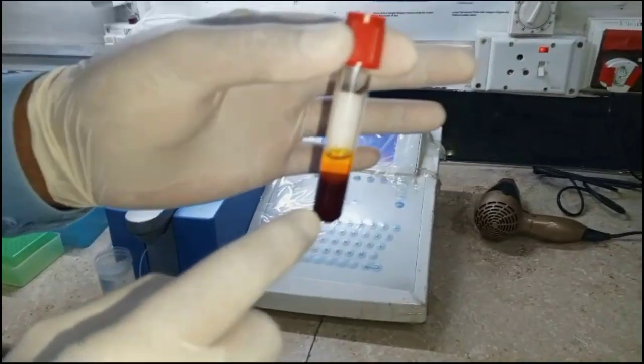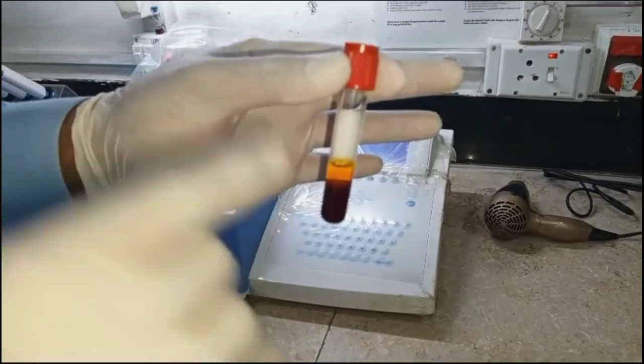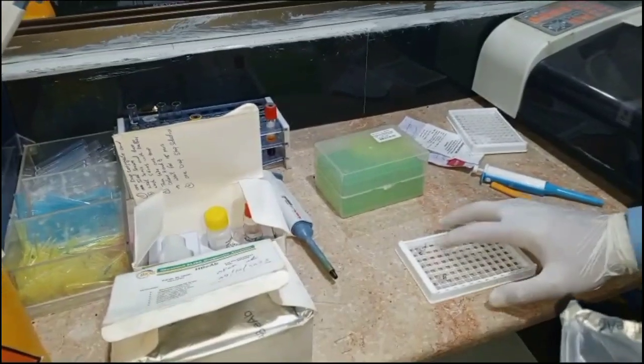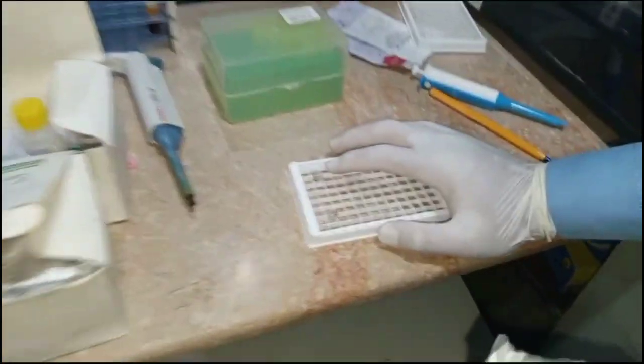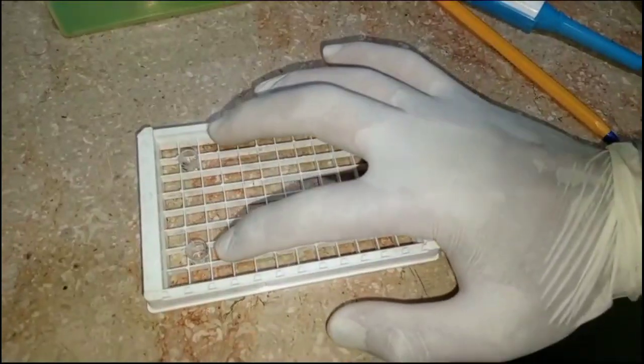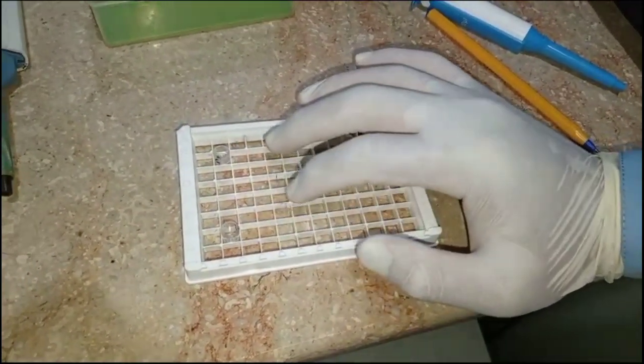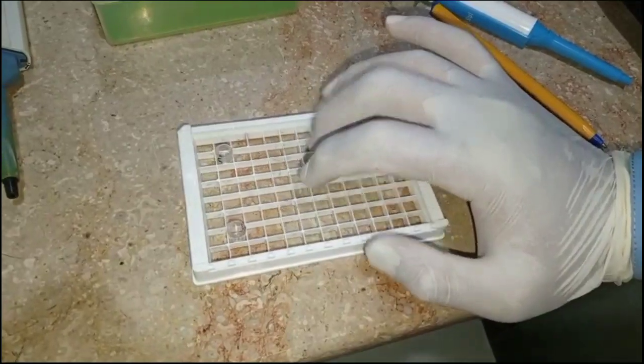Once the centrifugation is done, we get the serum. As you can see, this yellow one is serum and this red one is the RBC. Next we should take the wells. Now, this upper portion is for the Ab and the lower portion is for the Ag. So we should take the wells and place them into the ELISA plate.